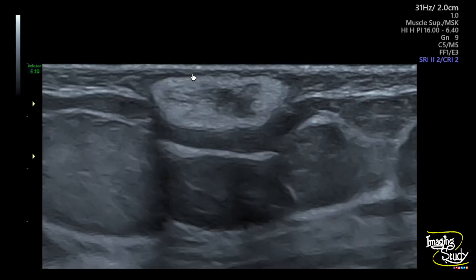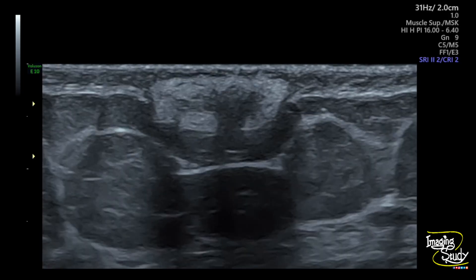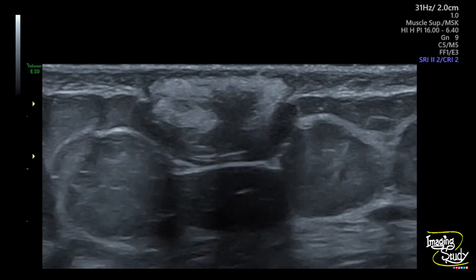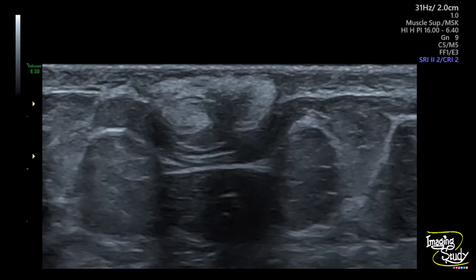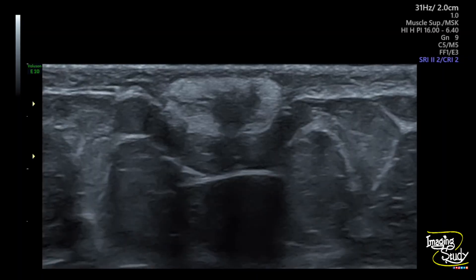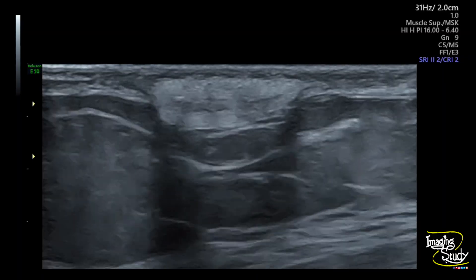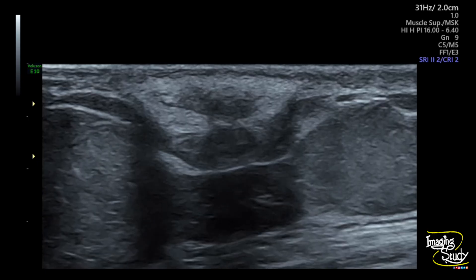Unfortunately I forgot to save the color Doppler pictures — I just found this when I tried to make this video. I can assure you that on color Doppler there was no apparent vascularity here.